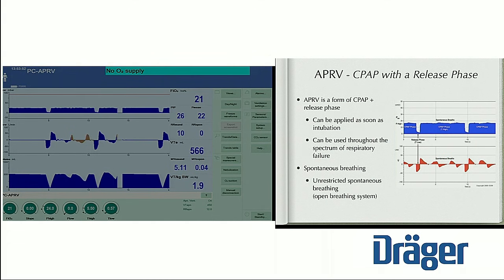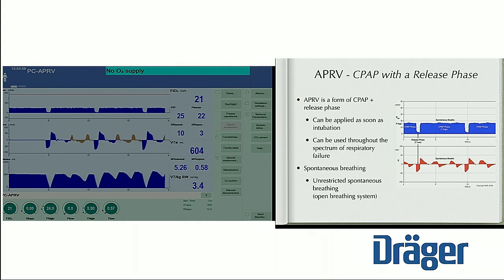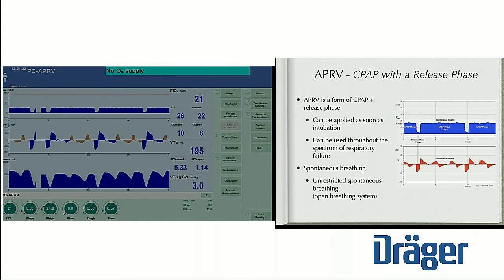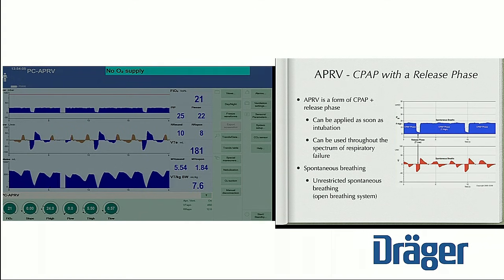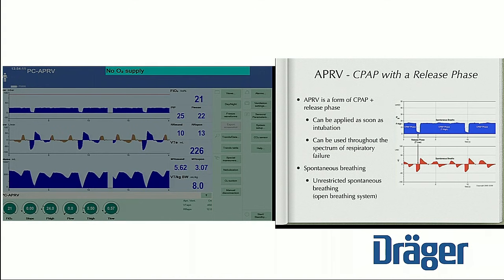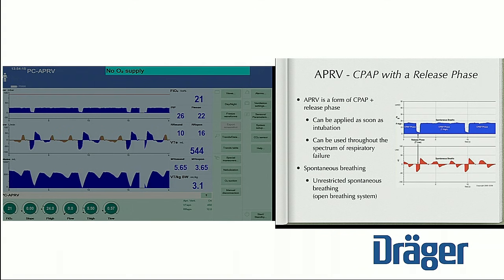If I were to color this area right here, this would essentially be a straight line and the patient would be doing 100% of their minute ventilation using APRV. As you can see here, the patient — who is actually Penny on a test lung — is actually breathing here. The gray breaths represent the breathing. If I colored this completely blue, it would seem just pure CPAP.